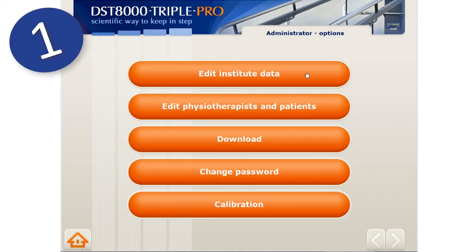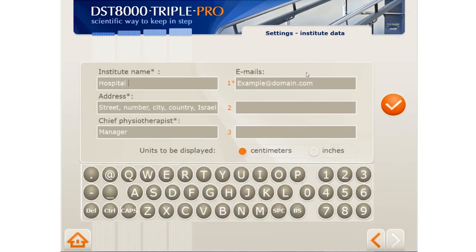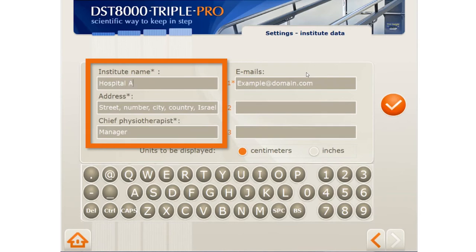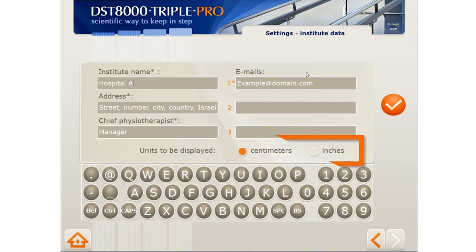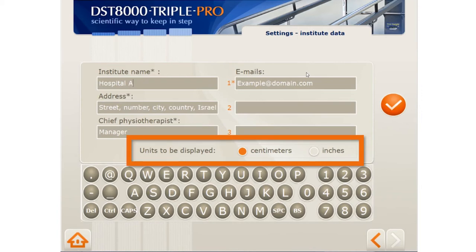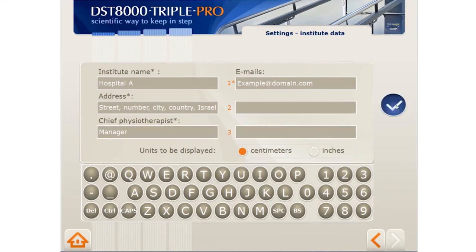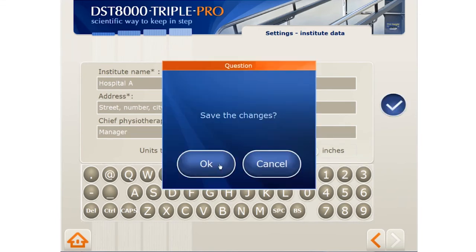First, you should edit your institution's information. Type your institution's name, address, and name of manager. In the right column, you can insert up to three emails. Whenever one of your PTs sends a patient's progress chart, it will arrive to the emails you list here. Here is also where you can control the measurement unit in the system — centimeters or inches. Clicking the V button will save all changes and take you back to the main page.